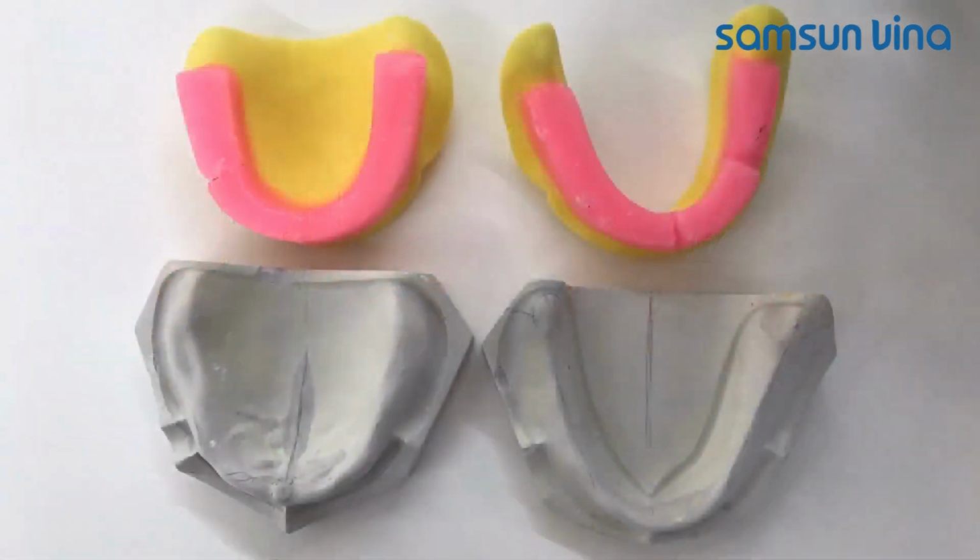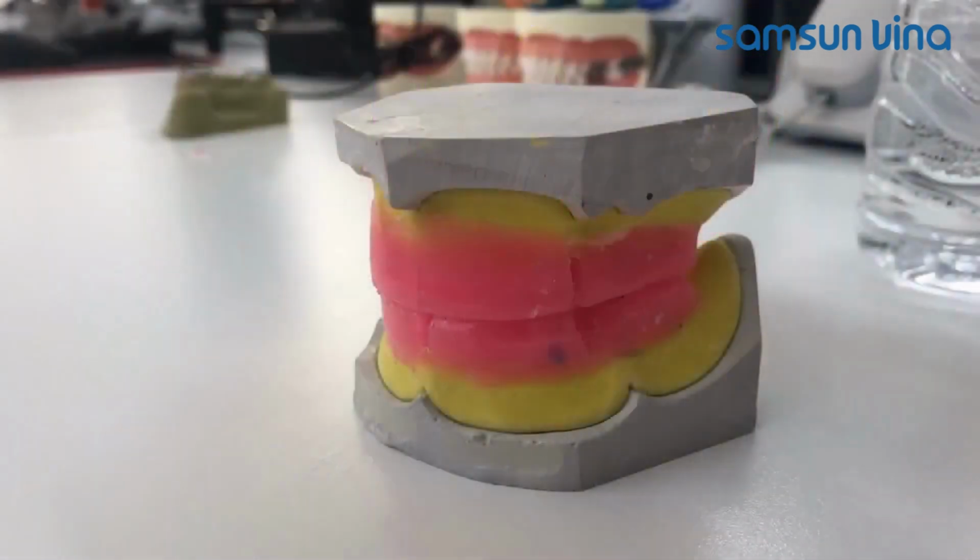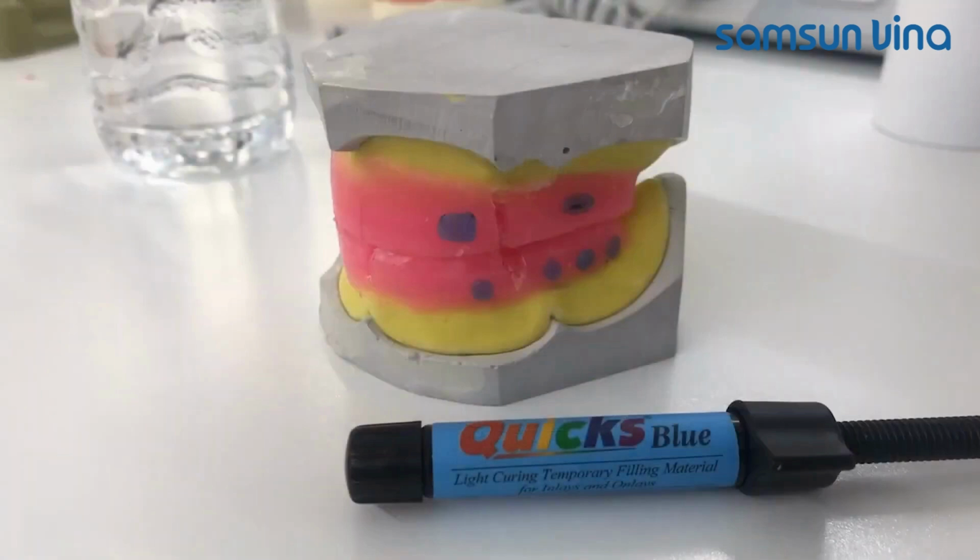Users will want to check the occlusal dimensions and the volume of the lips. Next would be to scan the occlusal with the wax rim placed in the patient's mouth. Users must also physically mark the wax rim to distinguish between the upper and lower jaw. This can be done with a pencil or resin.